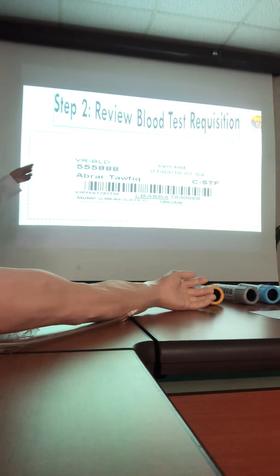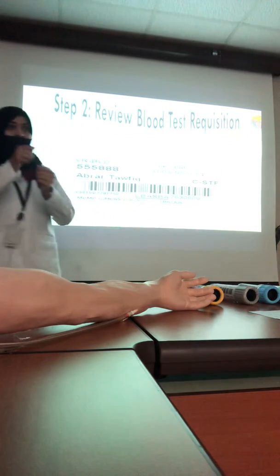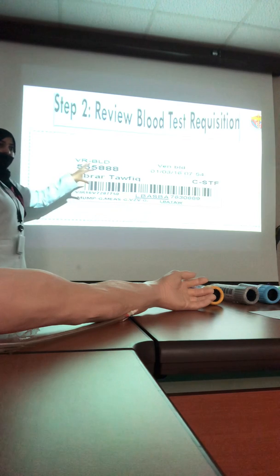This is the number of the sample. Only this number for this sample. The last one is for the number of this. Which one? This is the medical record number. Yeah. The one down is the sample number, the tracking number. So this one cannot be duplicated, inside the lab.